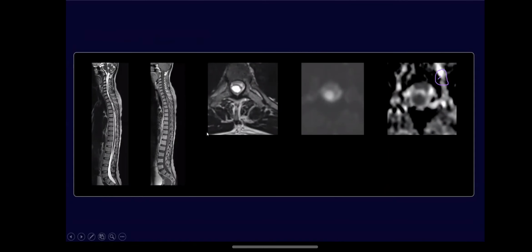So moving on now, this was a patient that presented to us with spinal cord compression symptoms. Really, it's not a very difficult diagnosis to make in terms of what we are seeing here. It's just going to be one of those cases where you define what's happening, right?